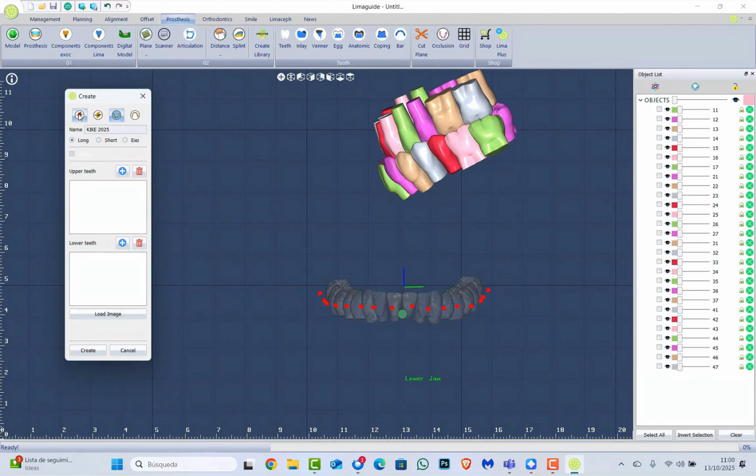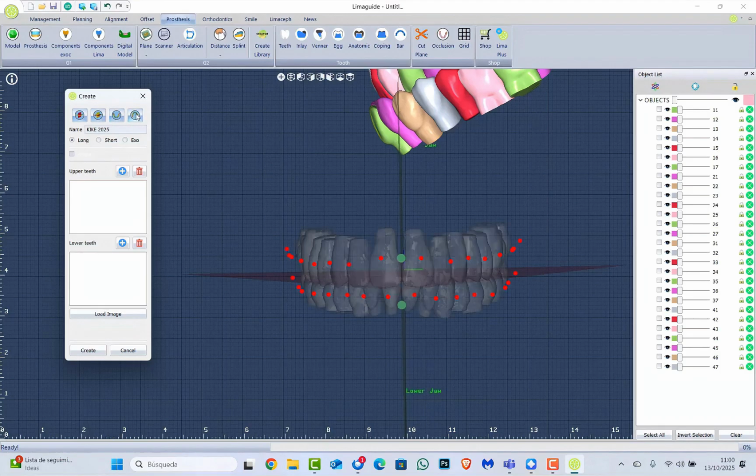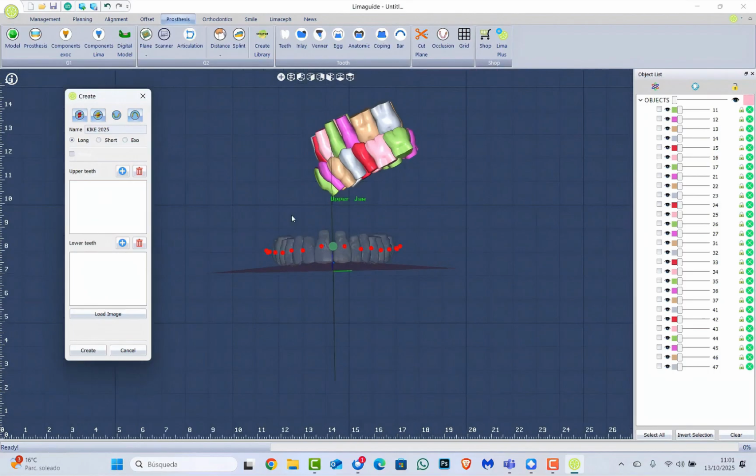Here we have these four icons. The first one is to make the horizontal plane appear and disappear. The second one is for the vertical plane, and the third for the lower teeth, and the last one for the upper teeth. I'm just going to keep the upper teeth, and I will tell in a moment what these two windows are for.